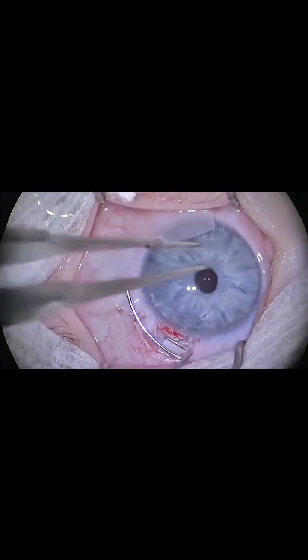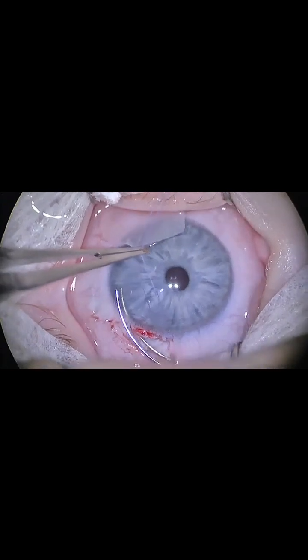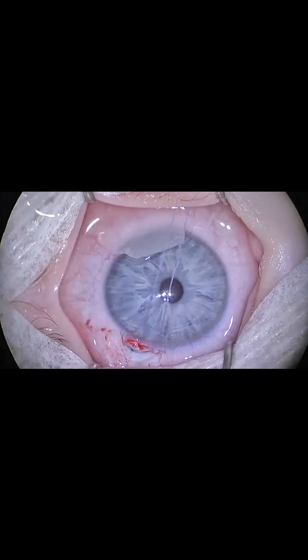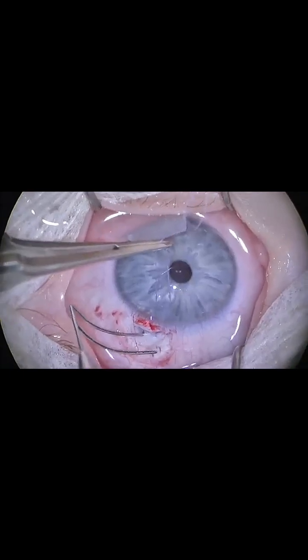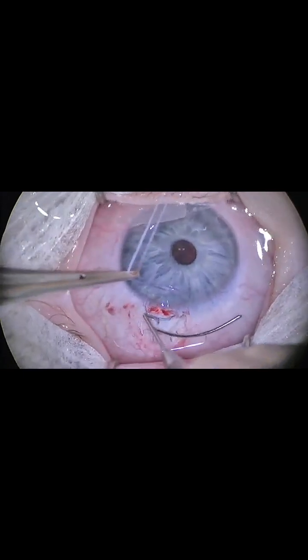The traction suture is then grasped to provide countertraction as the probe is directed towards and into the anterior chamber, thus opening and unroofing Schlemm's canal and trabecular meshwork before being removed. A gush of aqueous is noted. The procedure is then repeated with the Harms probe in a right-facing manner.